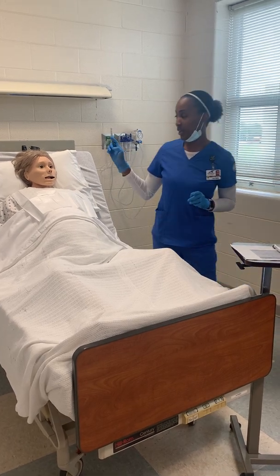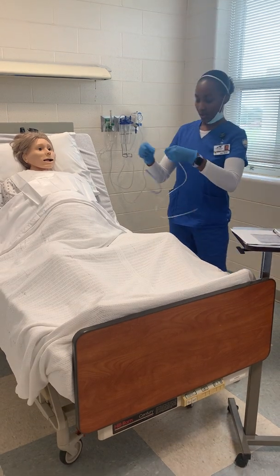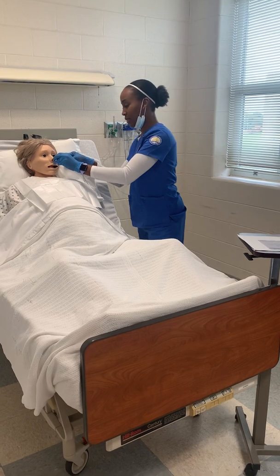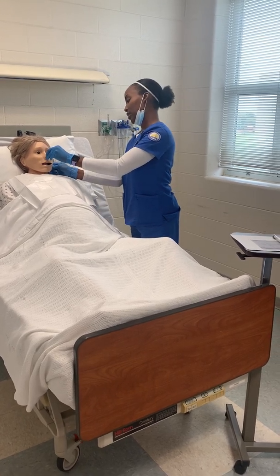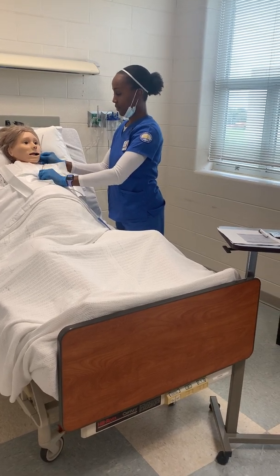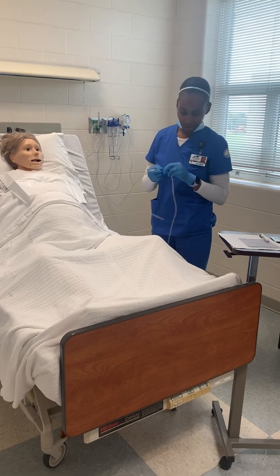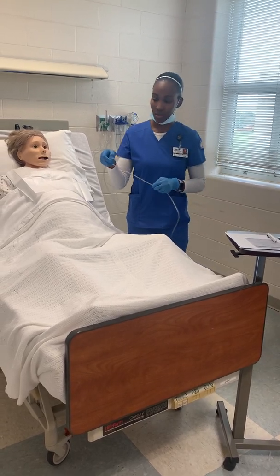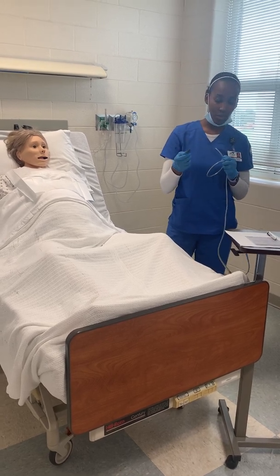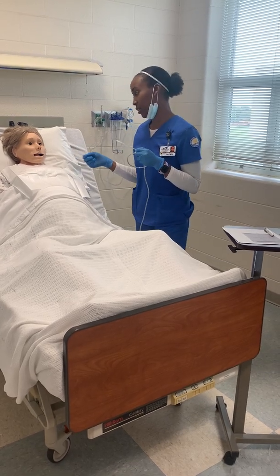So after I assess the nares, I'm going to get my tube and measure. So I'm going to go from the tip of the nose to the earlobe to her xiphoid. And then I will mark that with either marker or tape. Once I've got that marked, I can get my lube and lube 3 or 4 inches. And then we'll go ahead and insert.